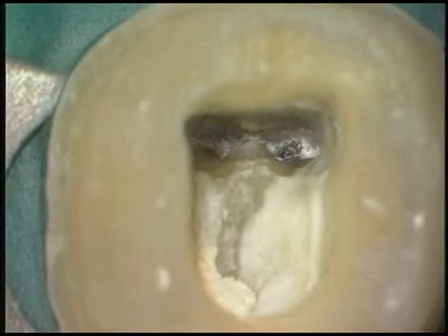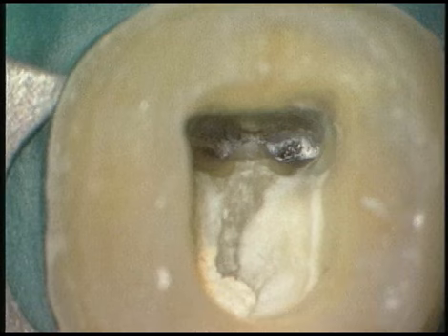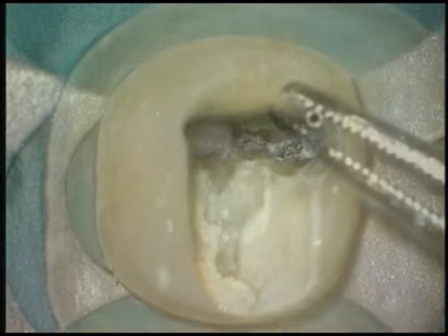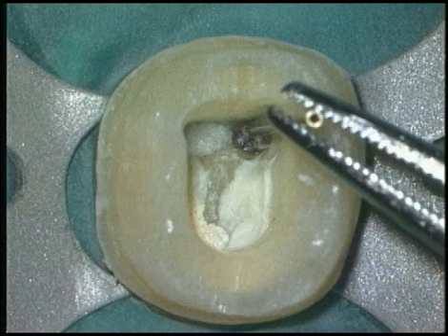Small hand files could be utilized in efforts to bypass the file. If hand files could create space lateral to the file, then the ultrasonic file adapter method could be employed. However, I will use a prototype IRS. Notice this pre-market version has no handle.